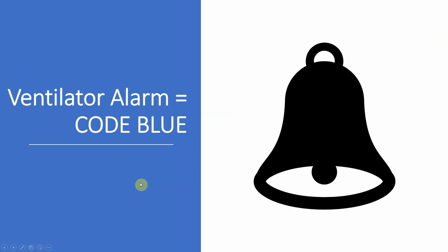A ventilator alarm is a code blue. Anytime a ventilator alarms, everyone should take this seriously. A lot of patients have died because nurses or physicians or RTs in the ER got what is referred to as alarm fatigue. They're used to hearing alarms and nobody thinks about it, nobody says anything. And this has contributed to quite a few patients' deaths.